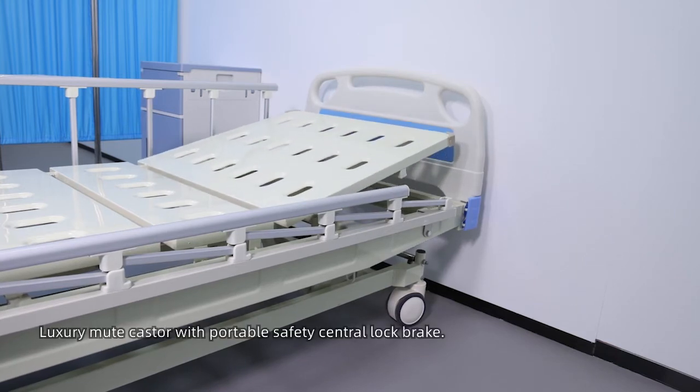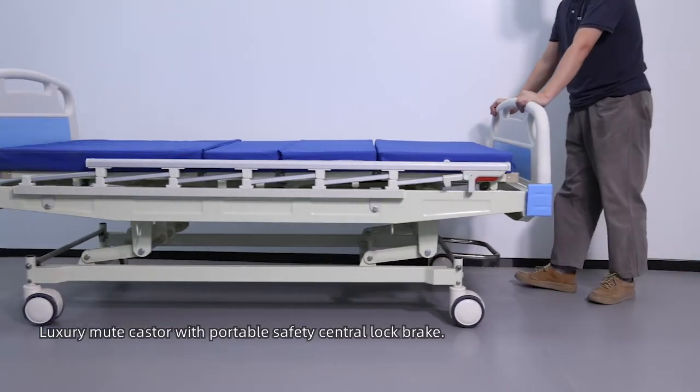Height adjustment 270mm. Luxury milled caster with portable safety central lock.